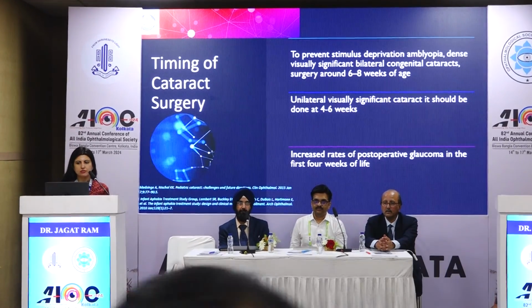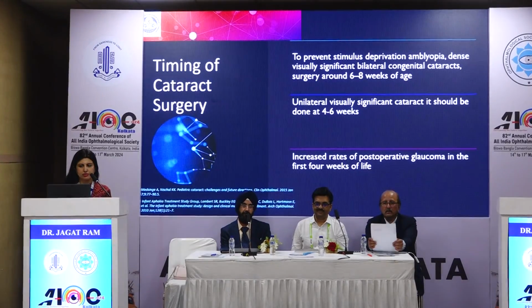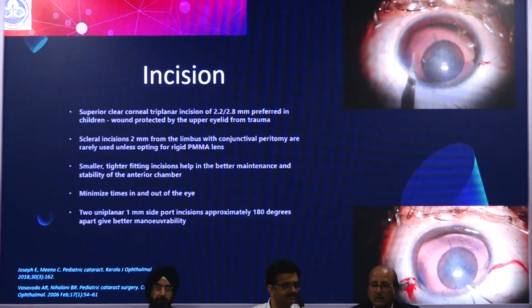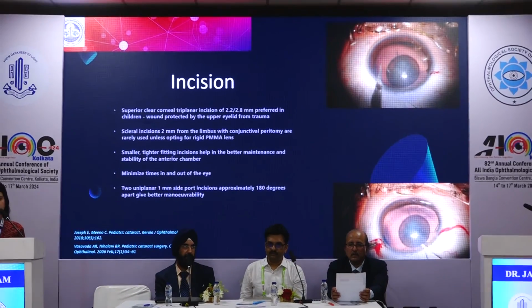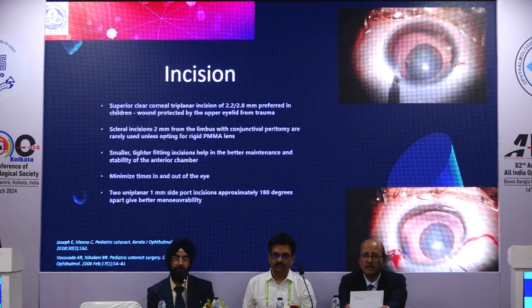So for unilateral, we usually operate between 4 to 6 weeks of age, and for bilateral, 6 to 8 weeks of age. However, there are increased rates of post-operative glaucoma in the first 4 weeks of life. So starting with the surgical part, the superior clear corneal triplanar incision of 2.2 or 2.8 mm is preferred in children, as the wound is protected by the upper eyelid from trauma.